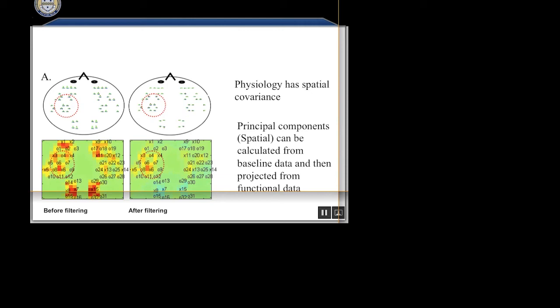So things like the cardiac oscillation are going to be very global features. That matrix is going to be very full because all the channels were moving together, okay? Other features like finger tapping or whatever are going to be much less dominant features. They only affected a smaller number of channels, okay?